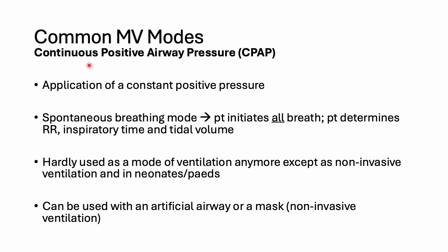CPAP stands for continuous positive airway pressure, and it literally means the application of a constant or continuous positive pressure. In other words, it is just one single positive airway pressure. That is also the baseline when you look at the pressure time graph. It is a spontaneous breathing mode. So anytime you hear someone saying, "This person is on CPAP," that actually means spontaneous breathing mode.